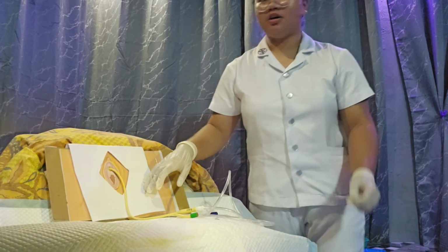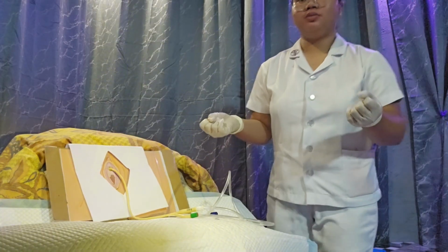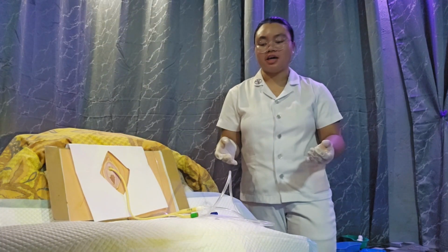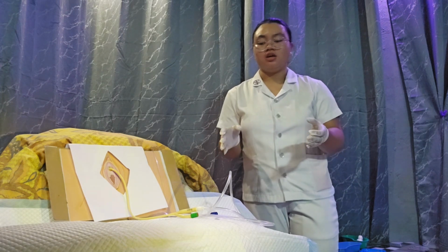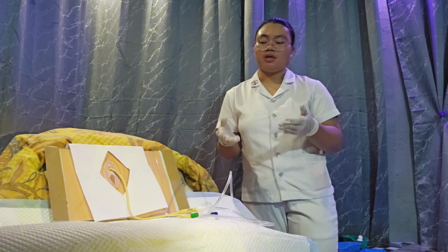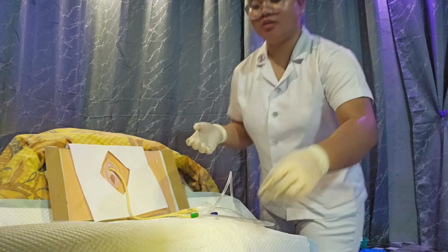So after wiping off the excess, we are now going to secure the catheter with tape onto the patient's thigh, ensuring that it's not too tight or too loose so that we still allow the patient to move freely.